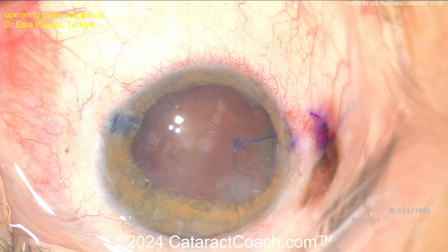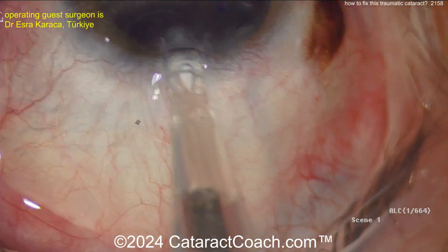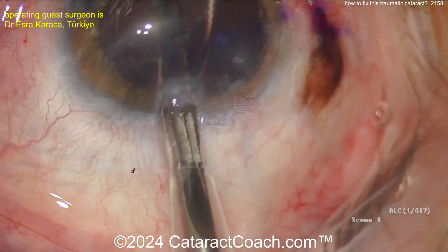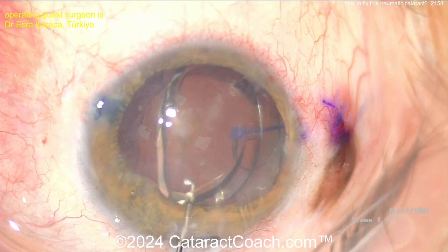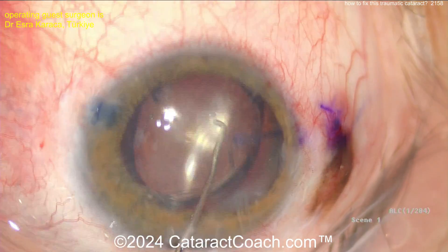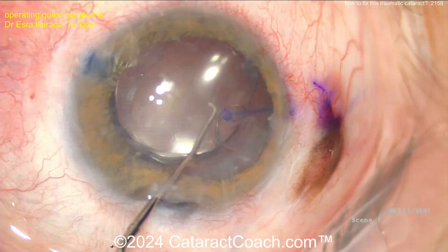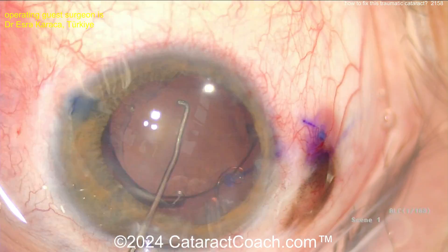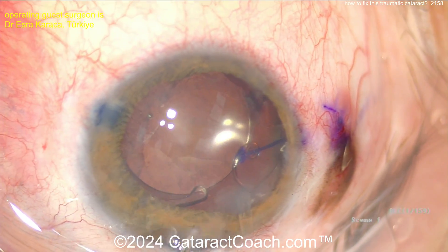Now it's nicely supported. Again, I'd like to bury that flange a little bit better — I don't like it just sitting there under the conjunctiva. Here comes the IOL going in, nice and easy. Looks like a single-piece acrylic monofocal lens. That looks good. Get that in the capsular bag — this patient will have a very nice outcome here.